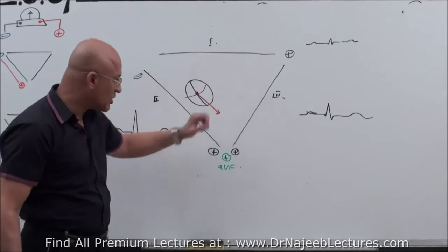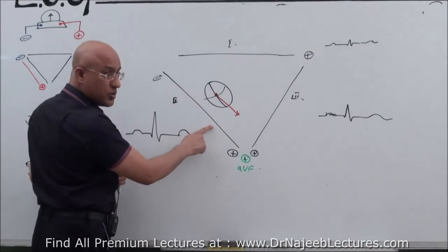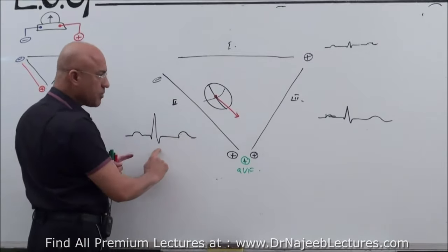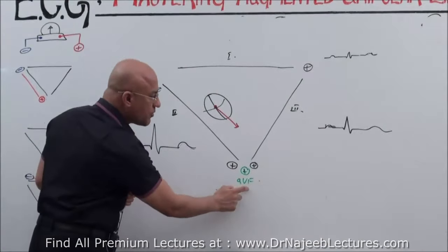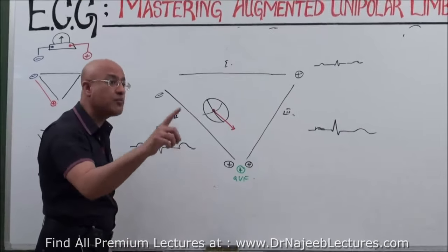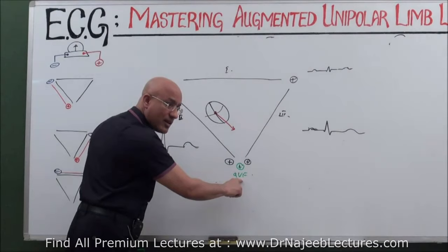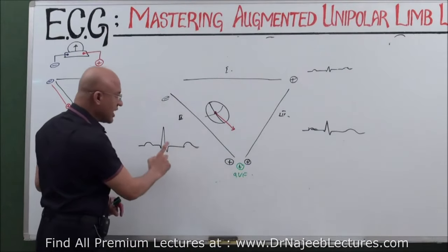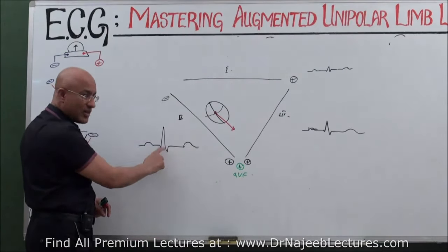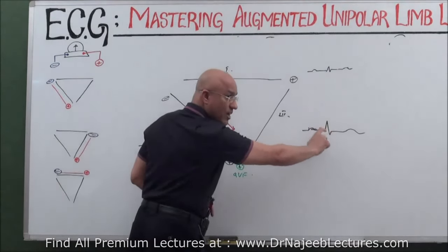Right? So if the vector is parallel to 2, there is best amplitude here. Here it is less. But what will be the amplitude of AVF? AVF will also have mainly positive deflections because it is also present somewhat down. So the vector is moving towards that. But its complex will be smaller than lead 2. Magnitude will be smaller than lead number 2 and slightly greater than lead 3.